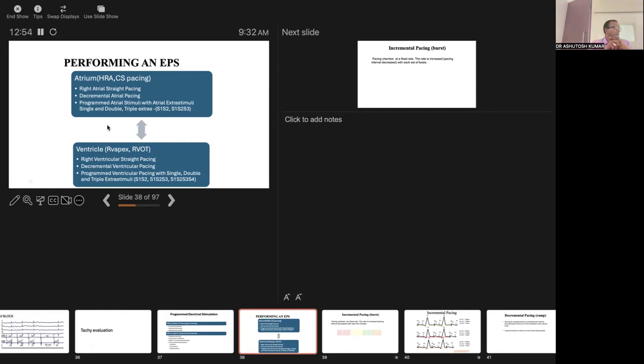We never put an HRA, high right atrium catheter, because we are keeping three: one in the ventricle, one in the His, and one in the CS. So we do a three-wire EP study. Sometimes we have to do a four-wire EP study, but most of the time we don't, because we have to puncture again and keep one more additional catheter.